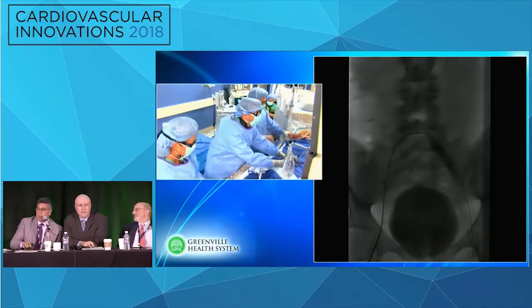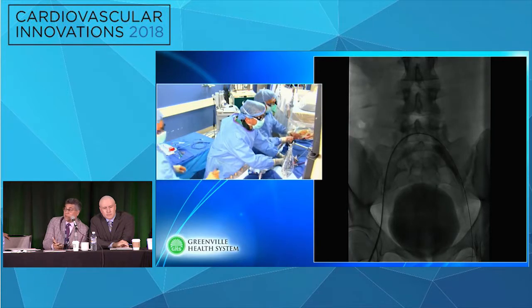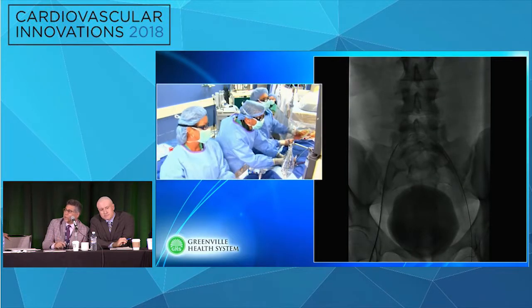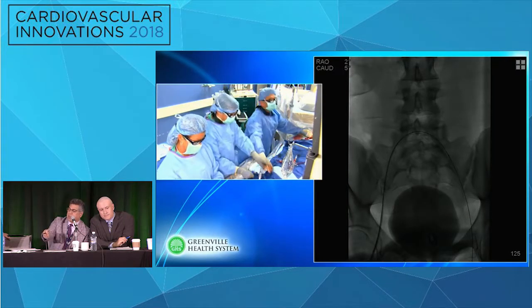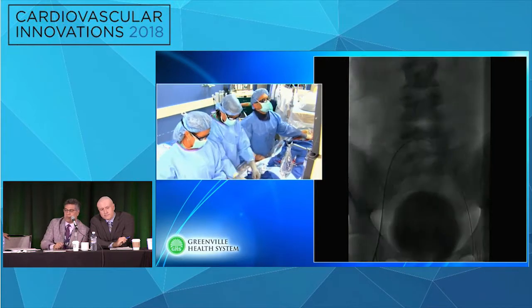Not a lot more to add other than the hardest part of this case that Bruce was able to show us very elegantly was getting into the ostial occlusion. To lose where that ostium was without crossing it would be an injustice. If there was thrombotic occlusion later, it's potentially going to be at that diseased segment of the common femoral vein, and that way you'd know how to get to it from up above. So that's what I would favor doing.